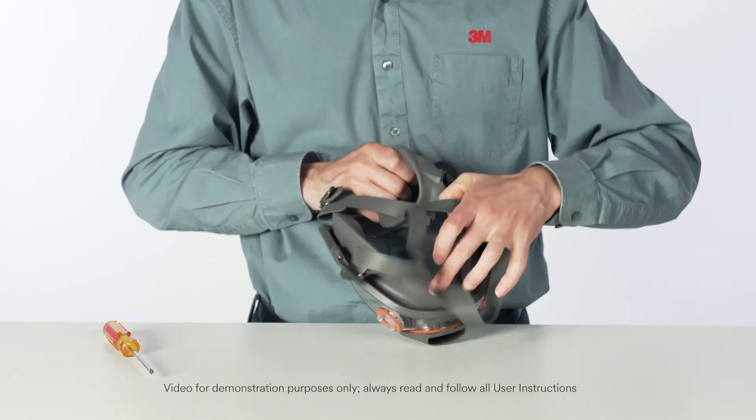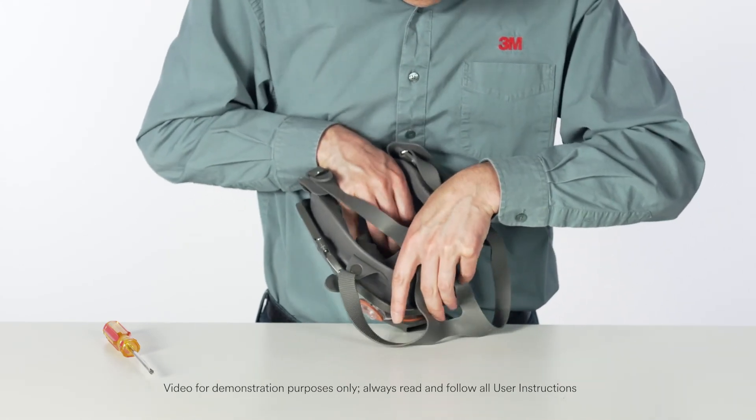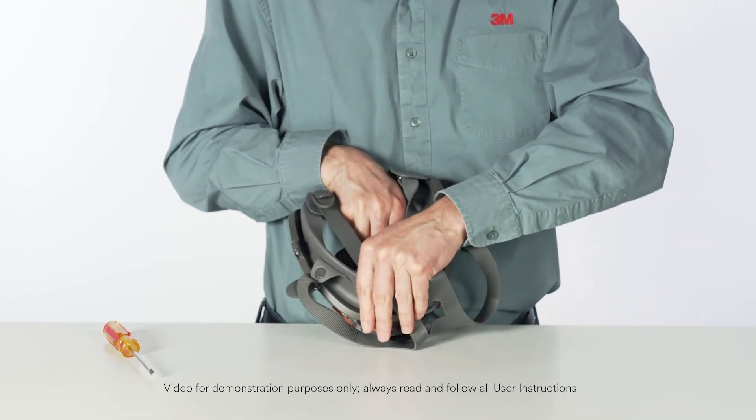Replace the nose cup assembly. Position the nose cup assembly onto the center adapter, aligning arrows. Make sure the nose cup is firmly seated under the center and side tabs.